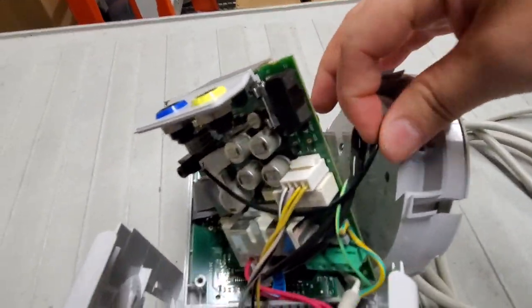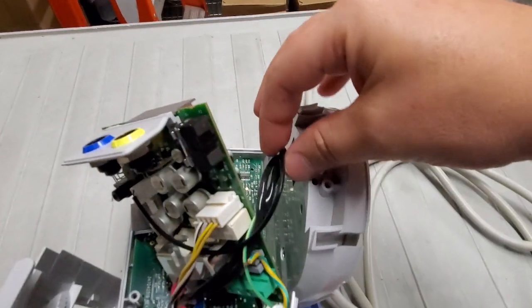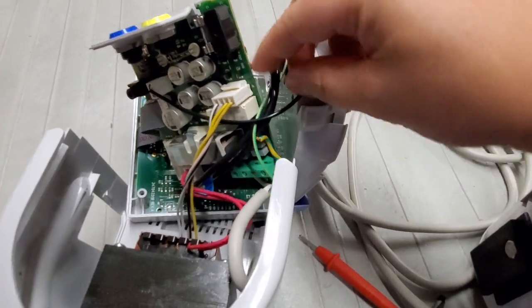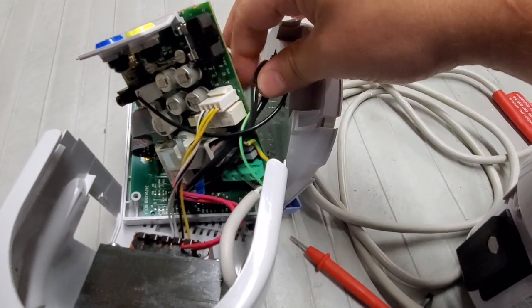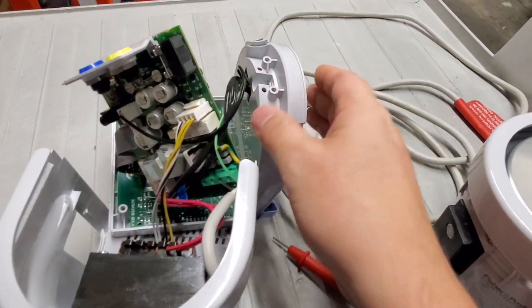Probably one or two of them are thermocouples. Yeah, like this one right here is probably temperature. And these ones here that have like this sticky type of coating, these ones here are almost definitely your power for the heater.